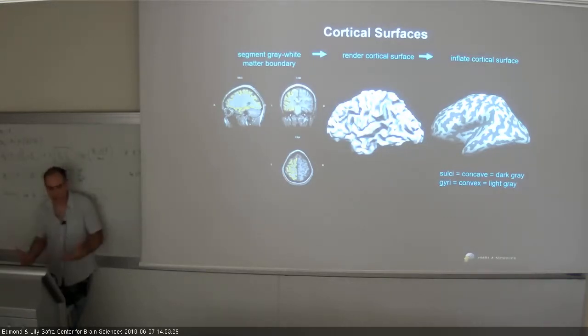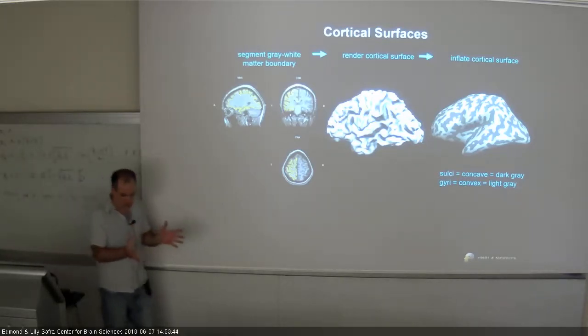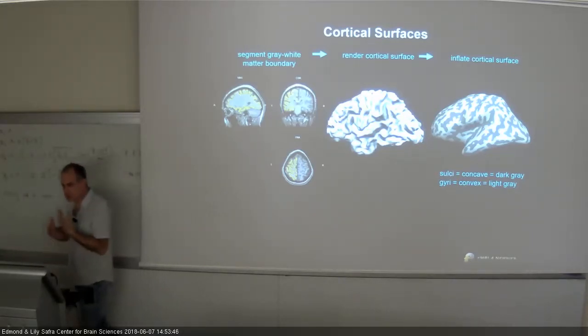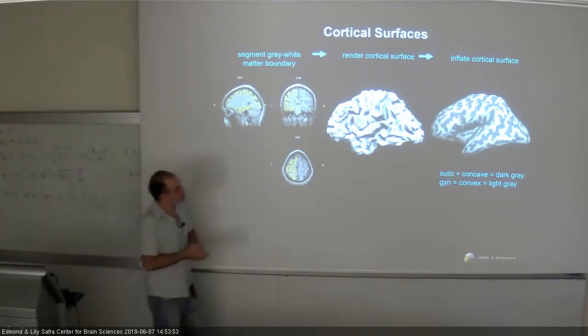So in the end, usually you go with your software. But from my experience, I would like to go with MNI, even though I did Talairach by now. But the idea is, again, you want to have a normalized space so you can do some group measurement and relate your work to other works, okay? And I think this will be the last slide for this part of the talk.